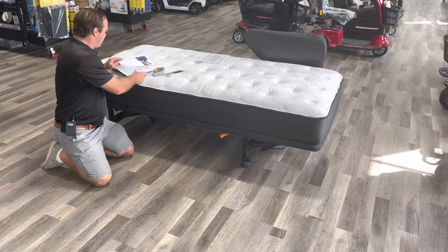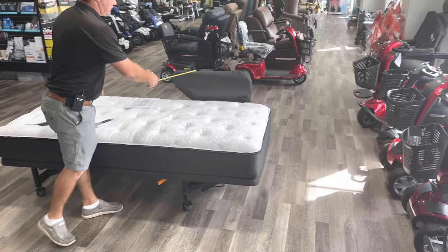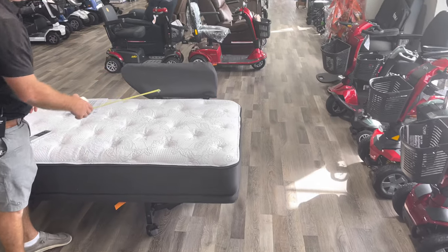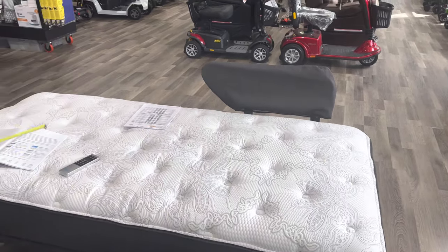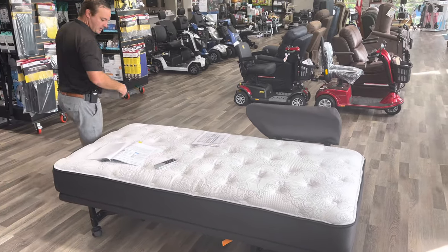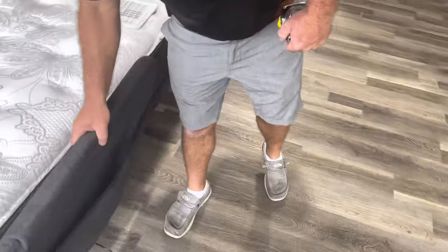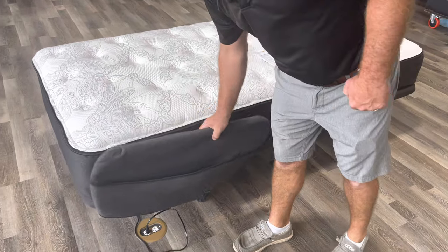The other thing to really consider when ordering is bed rails. You can order the bed rails at half length on one side, both sides, or at the foot end — you can order anywhere from one to four bed rails. Here's how they work: you just bring them up or bring them down.